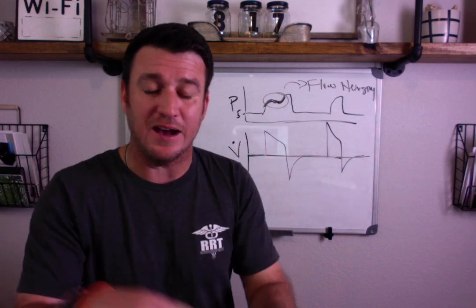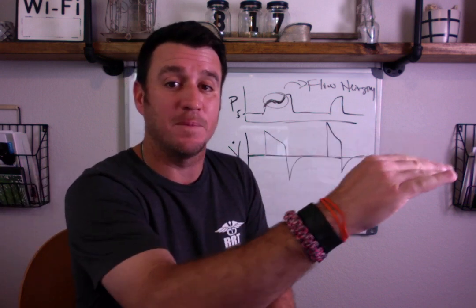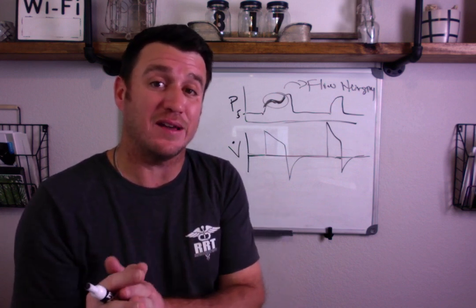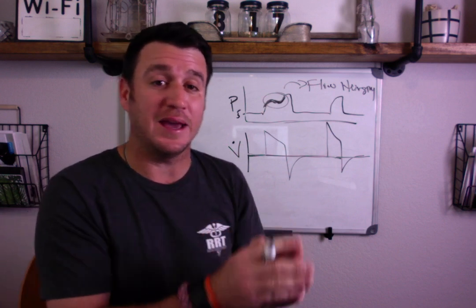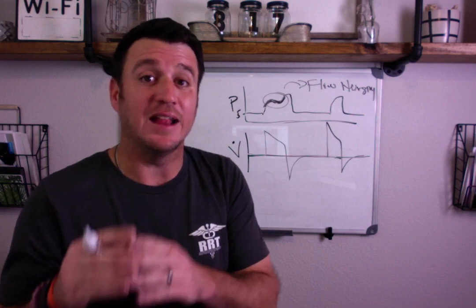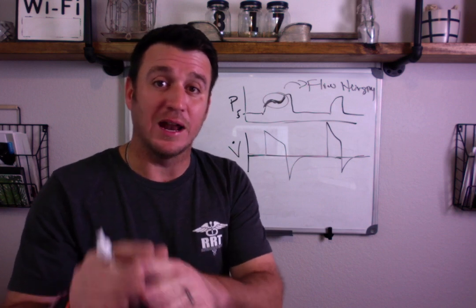As the rate came down, we dropped the flow down a little bit. We were like, okay, we've caught them up now. And now let's see if we can turn it back. We were down to 135. When we left, we gave the oncoming respiratory therapist report. And we said, hey, don't panic, but the inspiratory flow on this patient is 135. This is no lie. The respiratory therapist told me, well, I like 60.